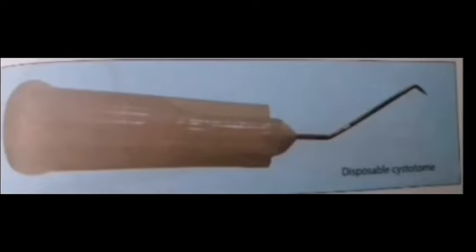Here we have cystotome or capsulotome. It is a small needle knife with a bent tip which is sharp on both edges. Disposable cystotome is prepared by bending the tip of a disposable 26-gauge or 30-gauge hypodermic needle at 90 degrees and the shaft at 45 degrees. It is used for doing anterior capsulotomy or capsular rhexis during extracapsular cataract extraction.